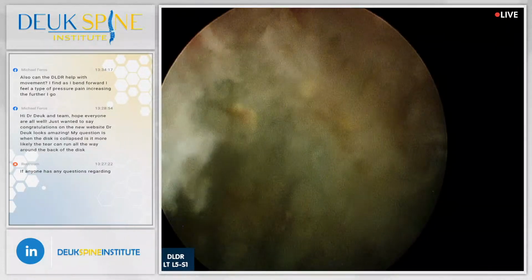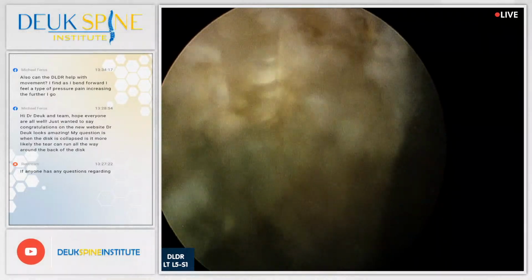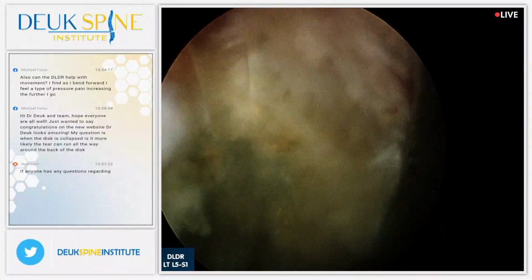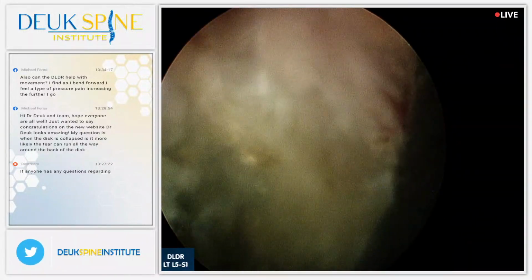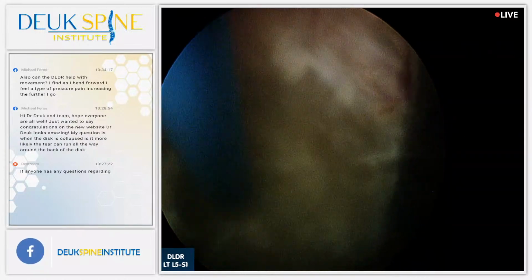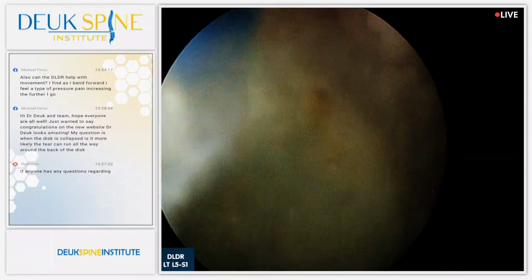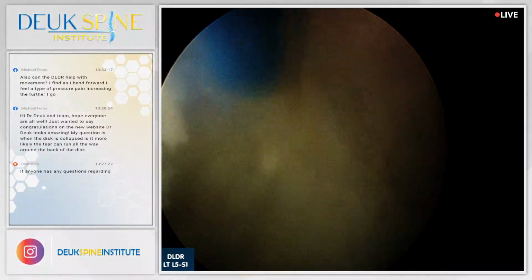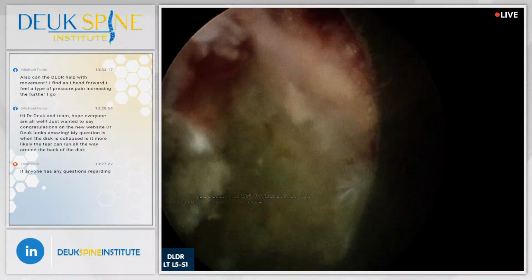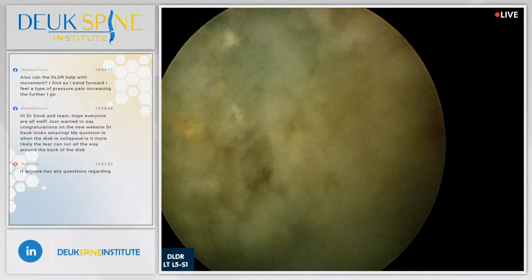By the way, that's the base of the herniation right there. You guys see it? Yes, we do. I'm literally inside the herniation, trying to use the laser, which is 1 millimeter wide, 1 millimeter. I'm using that laser to basically chop out or blast out, vaporize little pieces of herniation, slowly shrinking down the herniation. There's a name for this. In medicine, it's called debulking. Debulking. We are debulking the herniation. It means taking the bulk out of it.